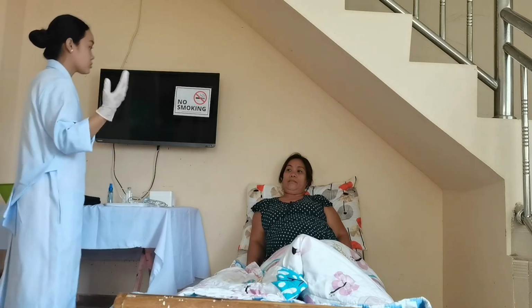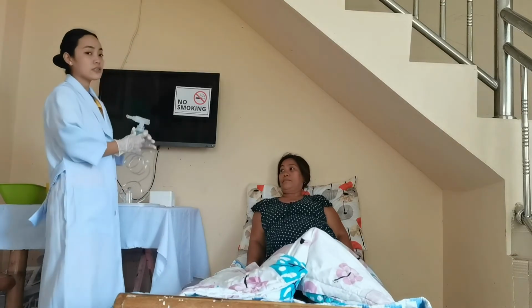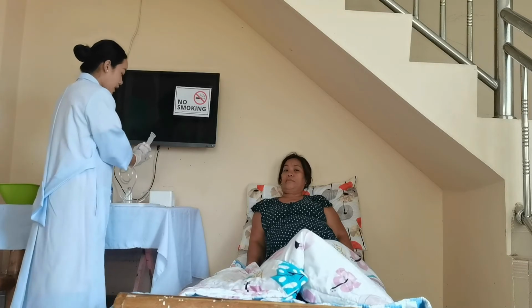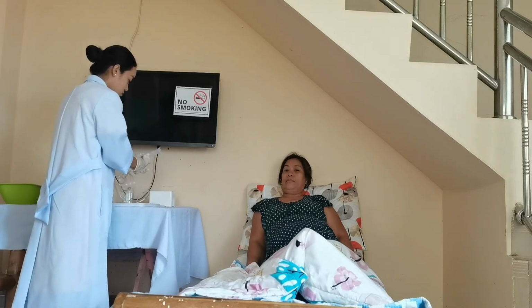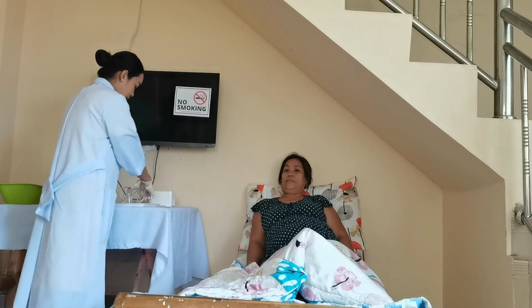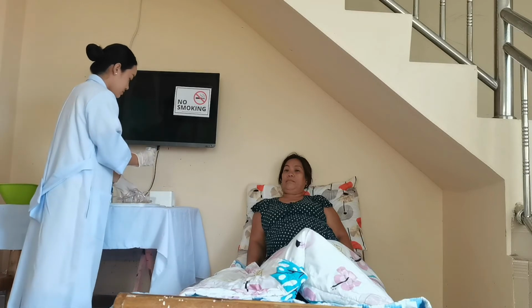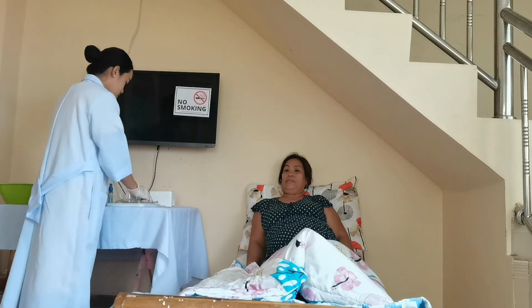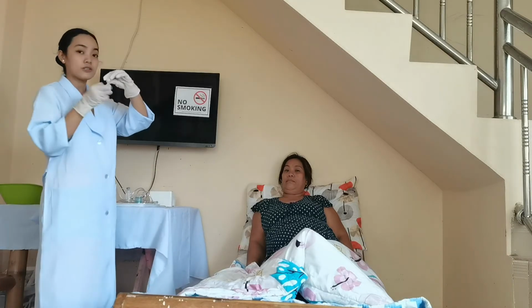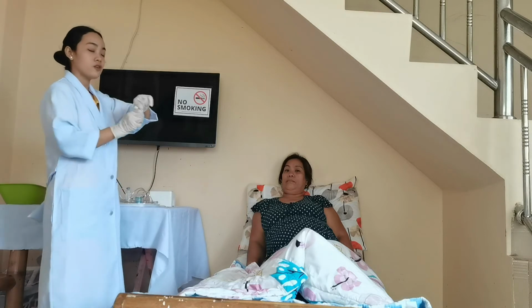So, ma'am, mag-start na po tayo mag-nebulization. Okay pa? So, the first thing that we must do is to remove the nebulizer cup from the device. And then, we will open it. Then after that, we are going to put the prescribed medication on the bottom of the cup and add the liquid if prescribed.